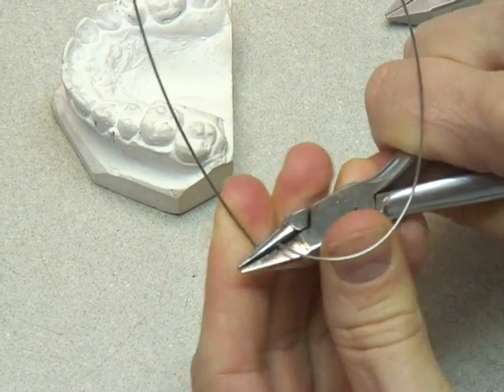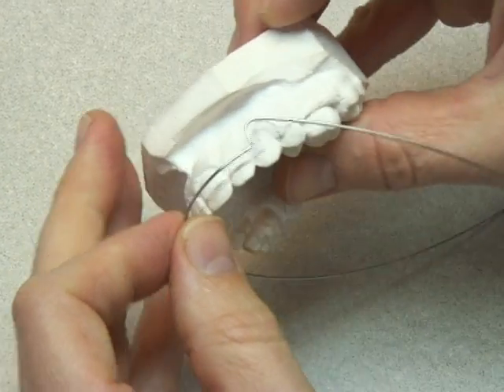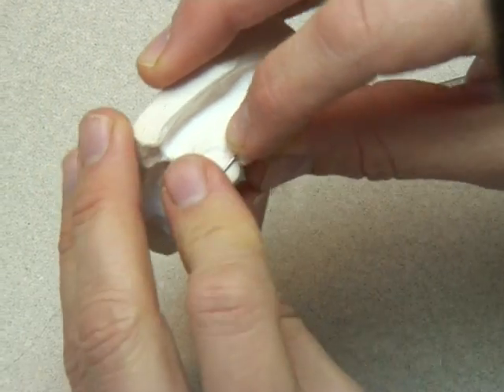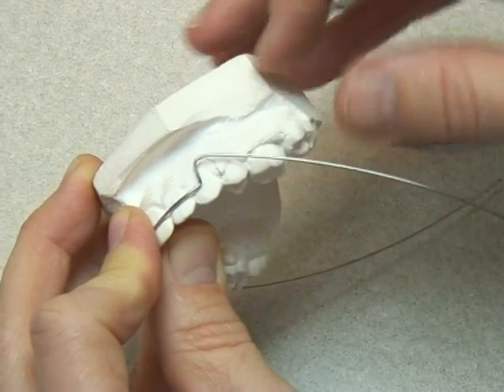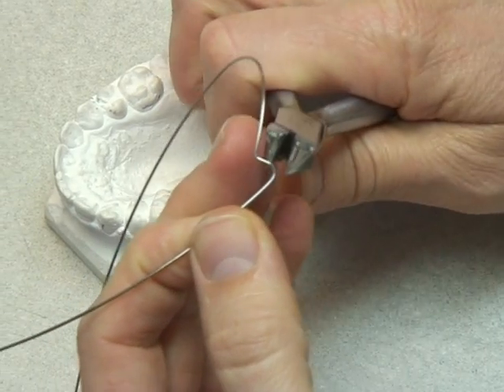This allows us to position it back on the model and check that we've got A, the right height, and B, the right direction of our U-loop. So we reposition our bow, making sure it's in the right position. Look at the height of that U-loop — you can see it fits on the model there because we'd bent that tail of wire out of the way, and it was in the correct place.